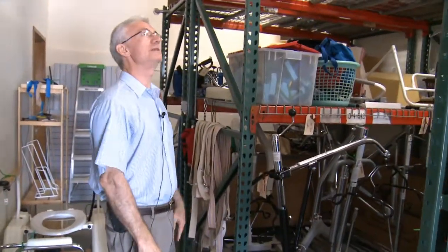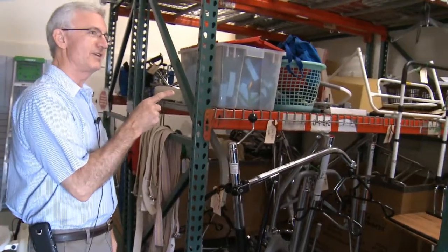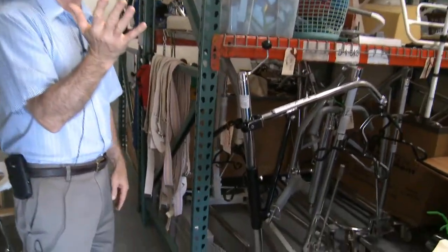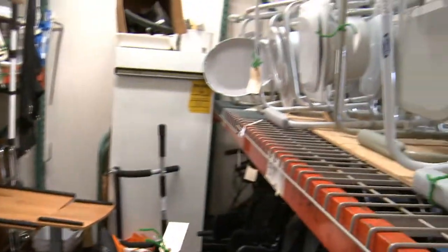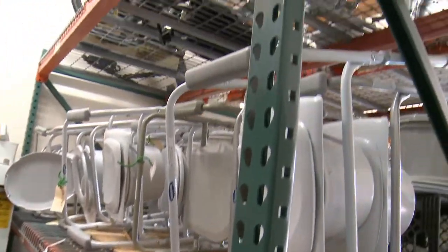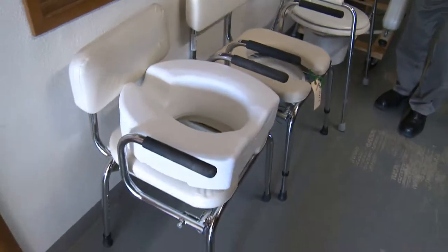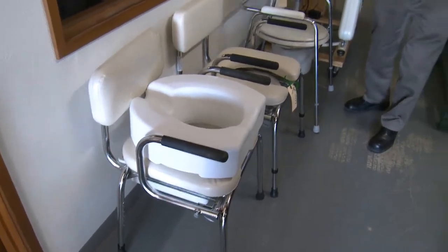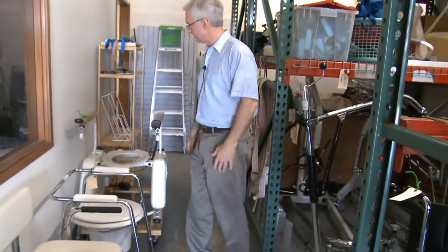We just try to get every piece used. In January I didn't have any commodes; now I must have two dozen — all this up here and over behind you. There are all kinds of different commodes: drop arm commodes, bariatric commodes, and just the regular ones.